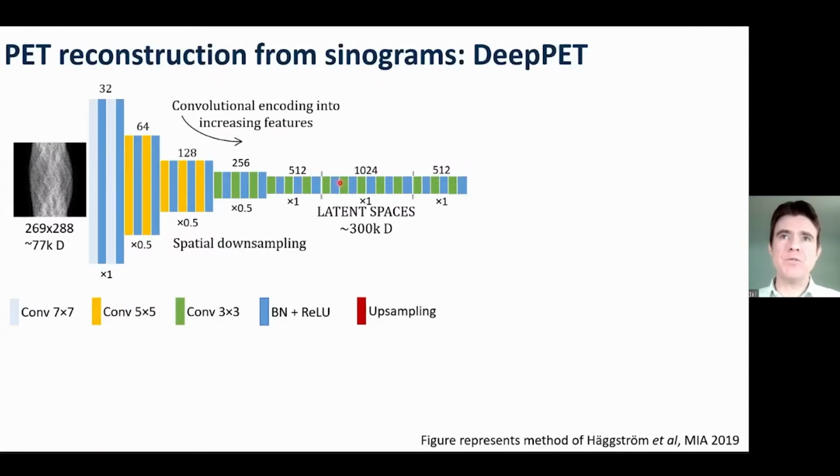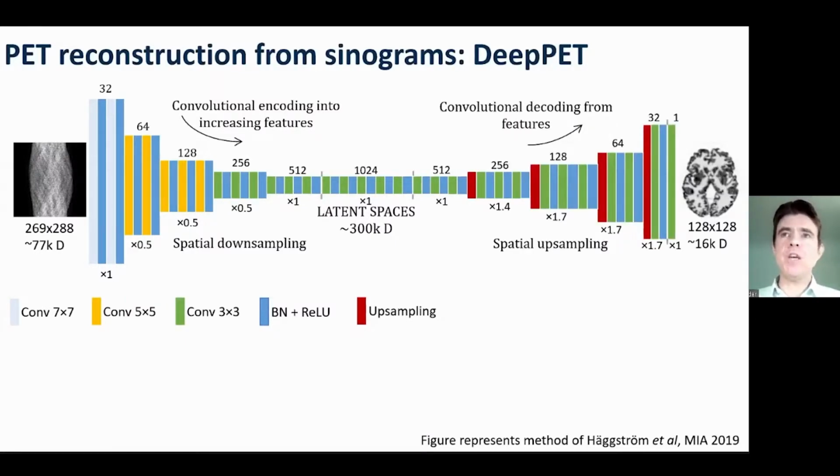these should actually be looking fatter and fatter, but obviously it's not very efficient on the slide to show that. Once you've encoded into that space, you can then decode back to your desired domain, which would be an image space representation of that latent information. And this is done, as implied, by doing the opposite of this downsampling.